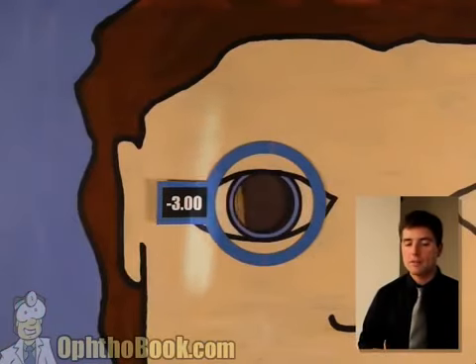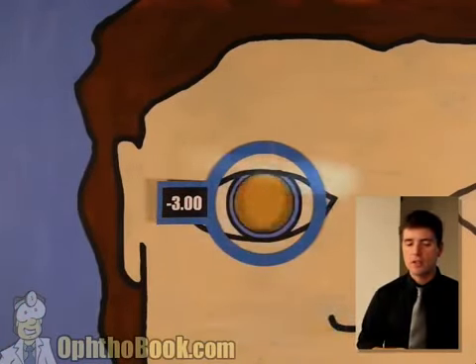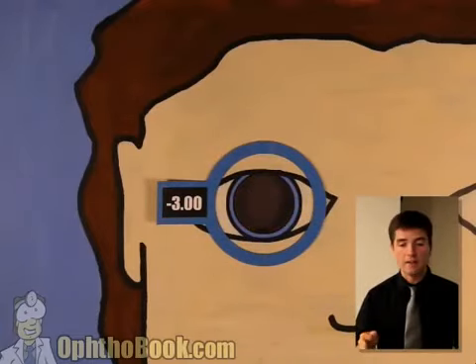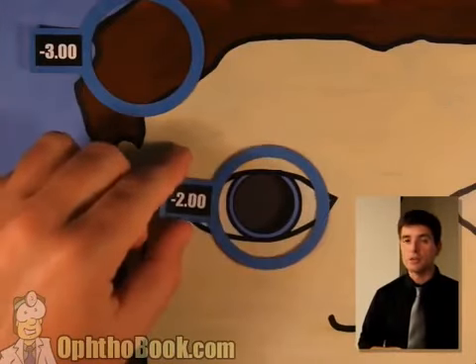So let's add a diopter, -3. We still have width, not quite there yet. Let's check the other direction. We've got it. We've got it this direction. Let's set this lens aside. Set it aside, you'll get confused. Just set it aside, get a stronger lens, and keep going the other direction.